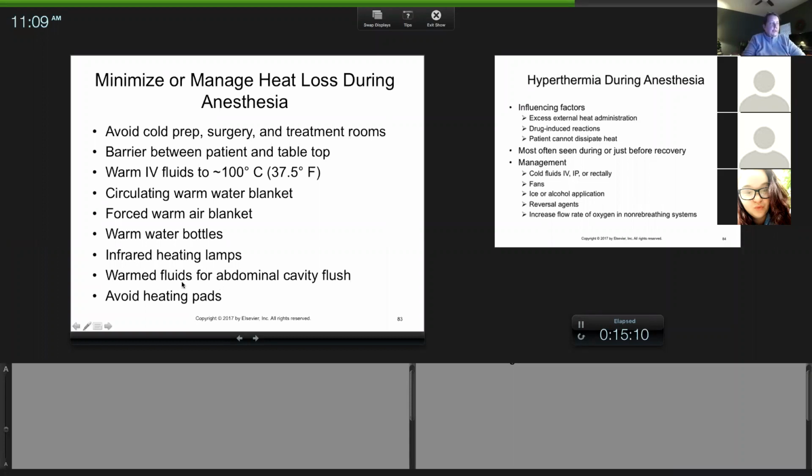In exotics, we tend to use heating lamps. You have to be careful that they're not too close. We just avoid electric, like pillows like a baby. You put pillows up next to a baby, we can use these. I'm just not a fan of electric heating pads. At BCA, we had this thing called a hot dog warmer. They said, go get the hot dog, and it's a different kind of heating pad too.